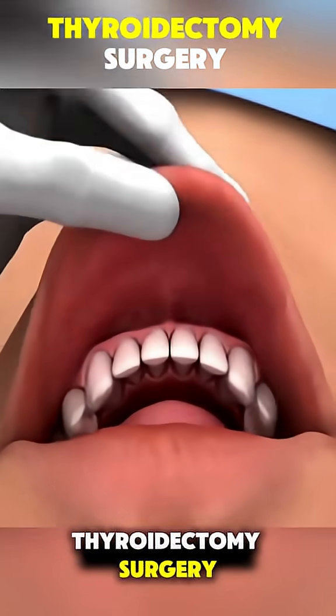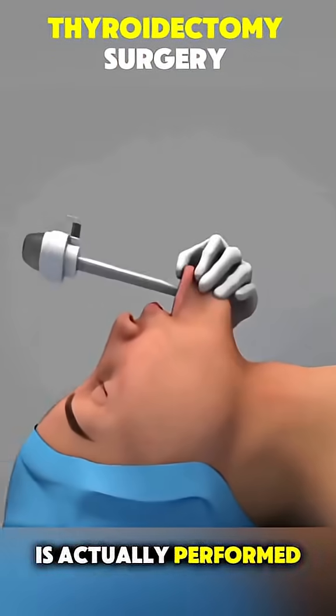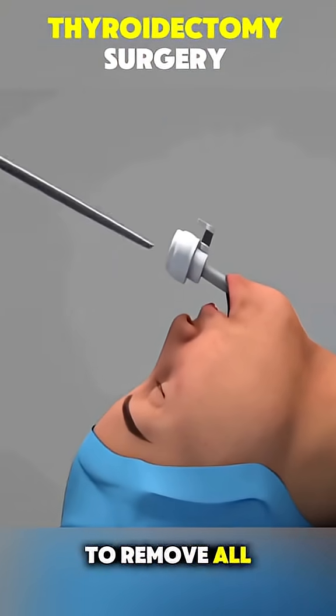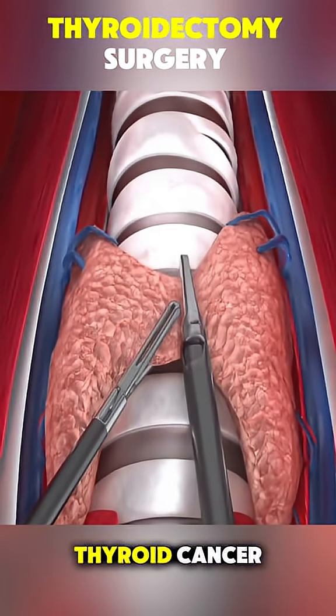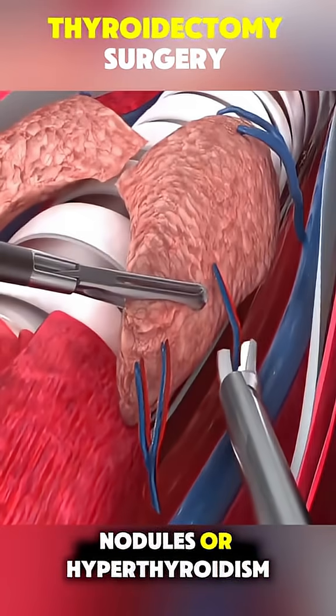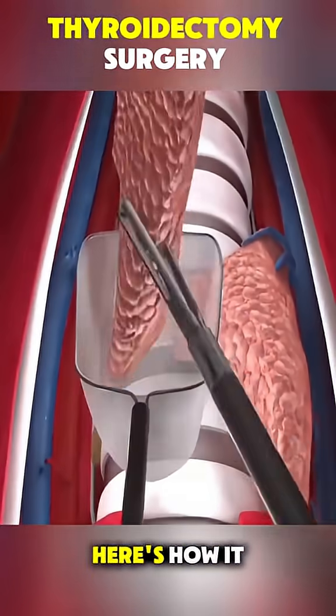Ever wondered how thyroidectomy surgery is actually performed? It's a procedure to remove all or part of your thyroid gland, usually because of thyroid cancer, nodules, or hyperthyroidism. Here's how it works.